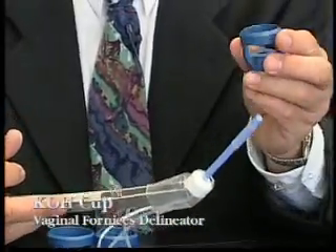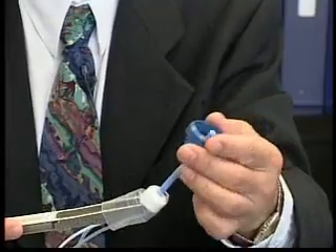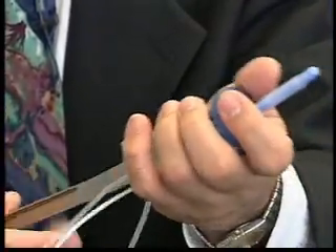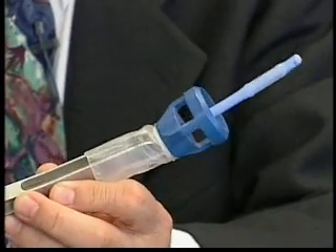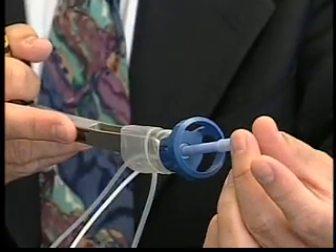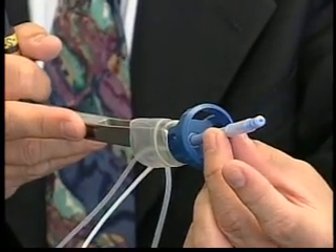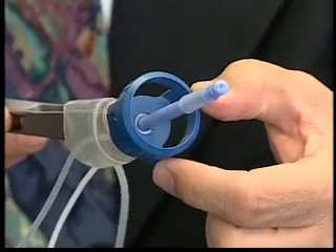Next, we use an appropriately sized cup and place it over the roomy uterine manipulator. This whole assembly is then positioned into the uterus, and we find the rim of the cup distending the fornix.